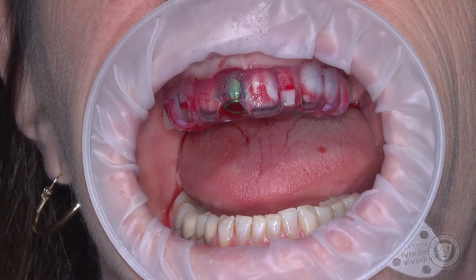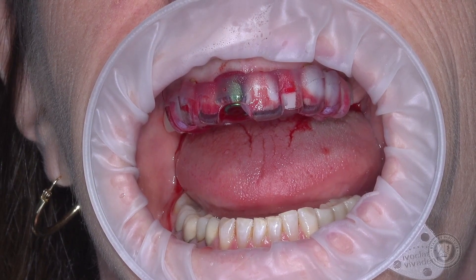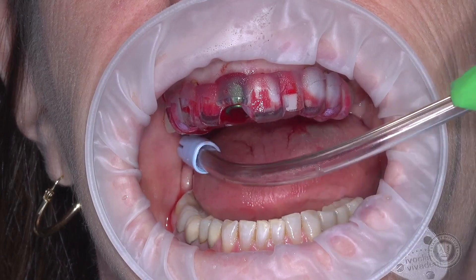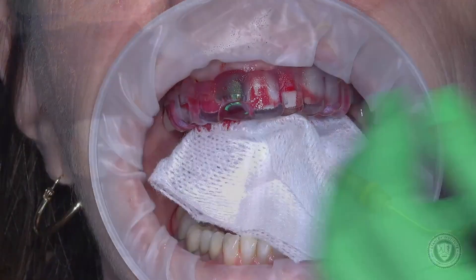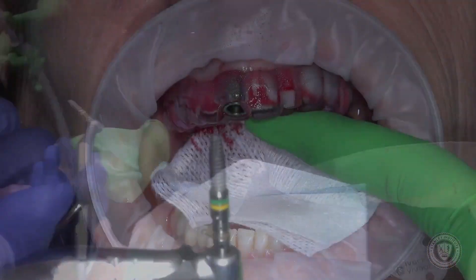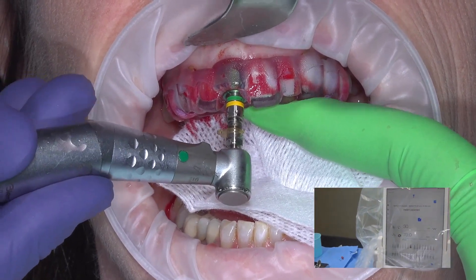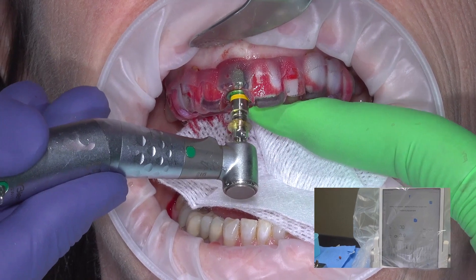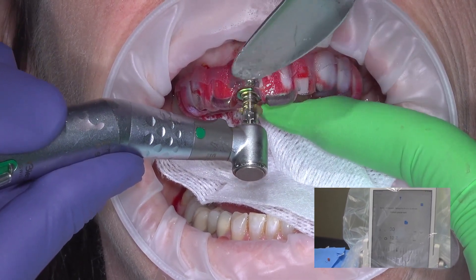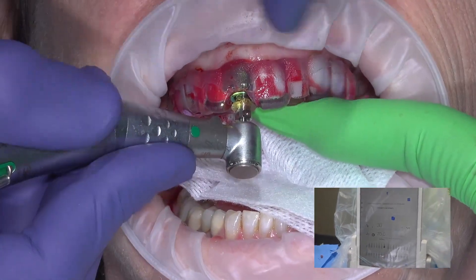This is our last drill. Now we're going to switch the motor over to implant mode. The surgical report came in and says our stop position is SP4. I'm picking up my implant — carrying it upside down — and my stop position has already been set by my assistant. We're coming to the mouth with this. I'm verifying that the speed has changed. This is a 4.2 implant going into position eight. We're going to wiggle it until it seats in the socket, lightly step on the rheostat, and drive until the snap link — that little piece of plastic — touches the top of the guide, confirming we're at the right depth. This is a prosthodontic-driven protocol: starting with the end in mind and backing into the surgical position.